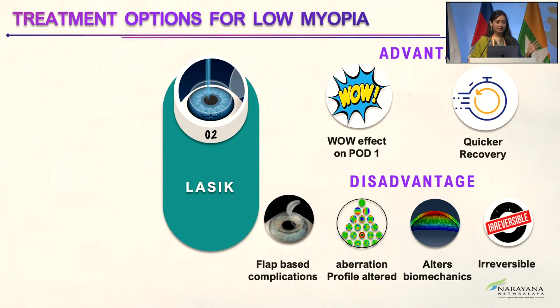Now, when it comes to LASIK, all of us are very comfortable with it because it has the wow effect on post-op day 1. 99.99% of the time you don't have to worry because the patients are happy, and that's what they want: day 1, good quality and quantity of vision, and a quicker recovery. However, it's a flap-based complication, so if you have any patient who's into contact sports or army or anything, you cannot technically offer this procedure to them. The aberrations do get altered, and if it's a very high myope or a very high cylinder, sometimes the contrast sensitivity can drop.